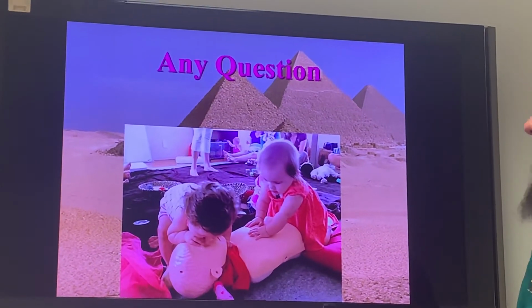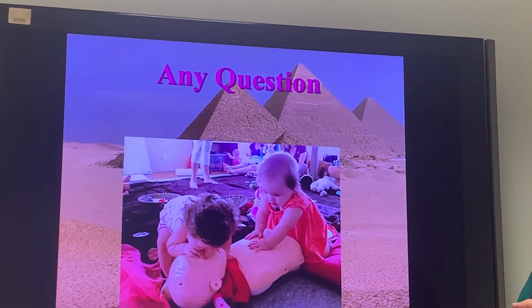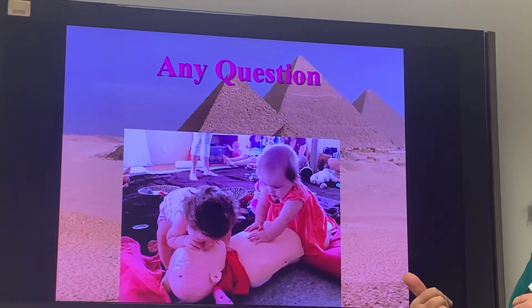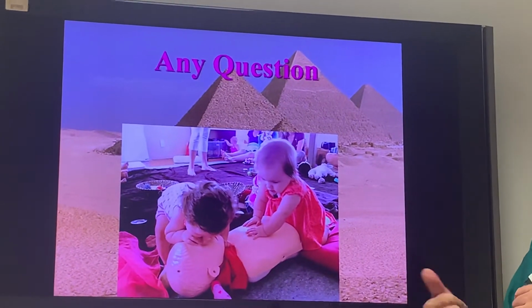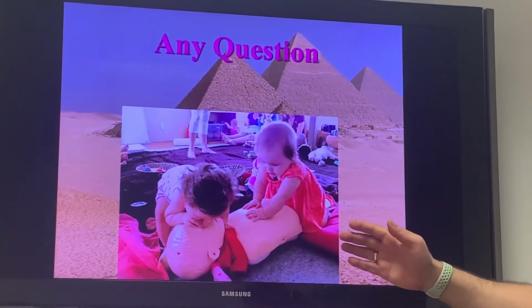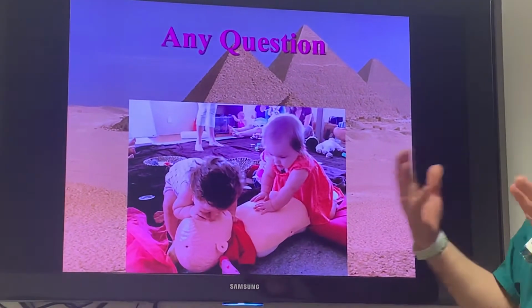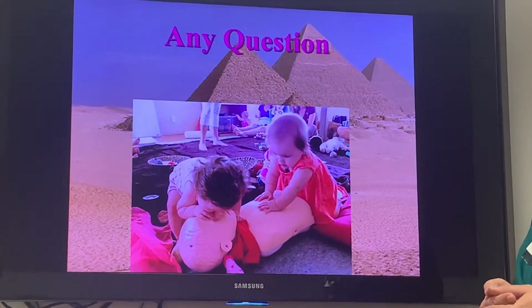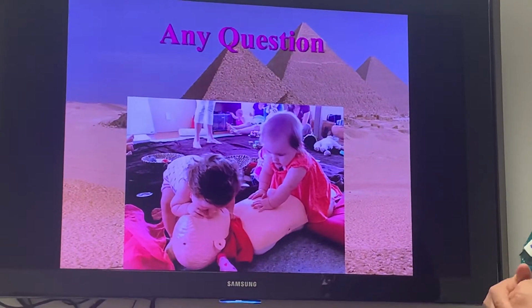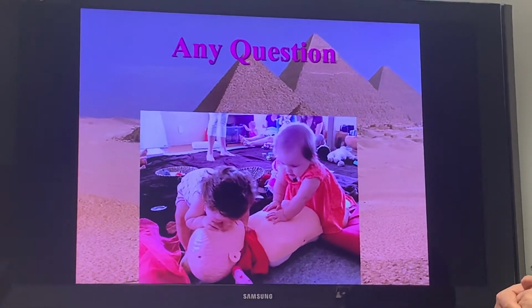Till that, do you have any question? We have discussed left bundle with ST segment elevation, how we can define MI in presence of left bundle. The first point is new left bundle is MI until proven otherwise. Even I don't look at Sgarbossa criteria if it is new for me. But if it's an old one, then you can apply Sgarbossa criteria to see if he has an MI on top of left bundle. And we have covered the ST depression, which is simple, and non-specific ST segment depression. Any question to that level?